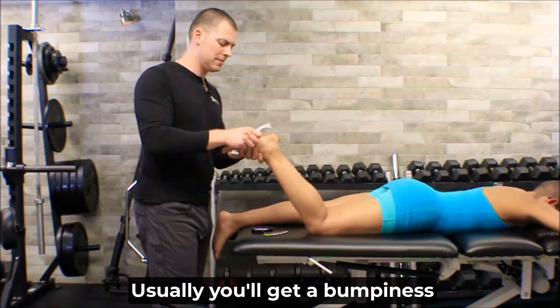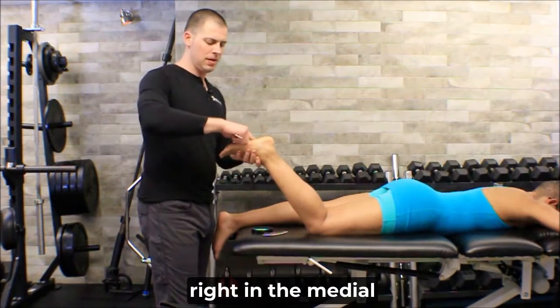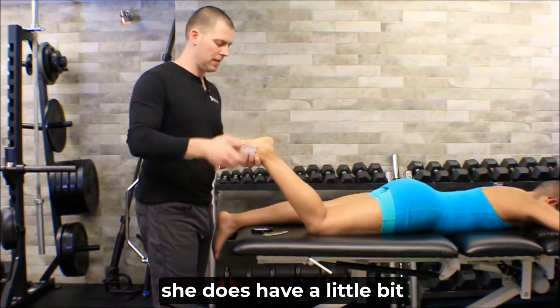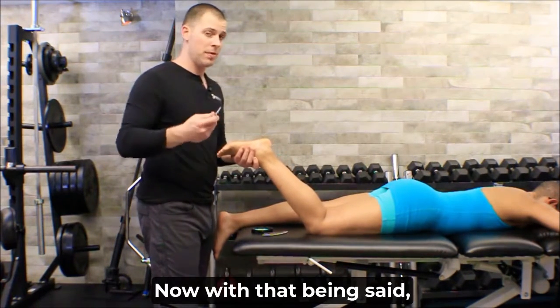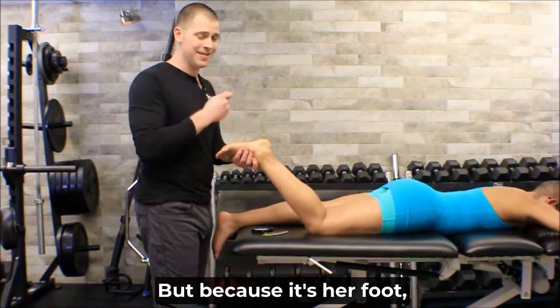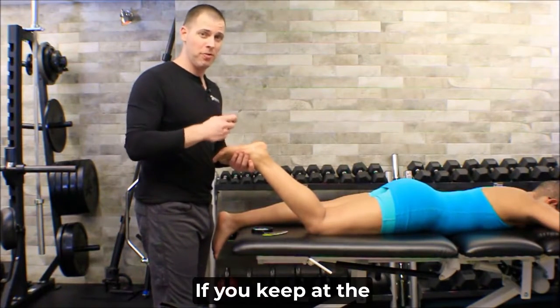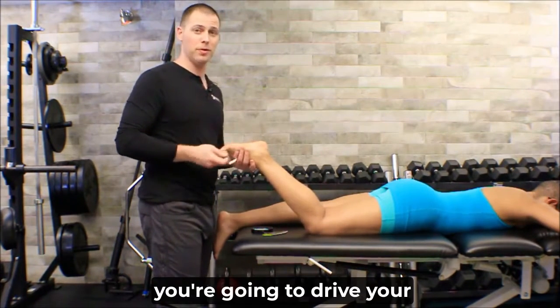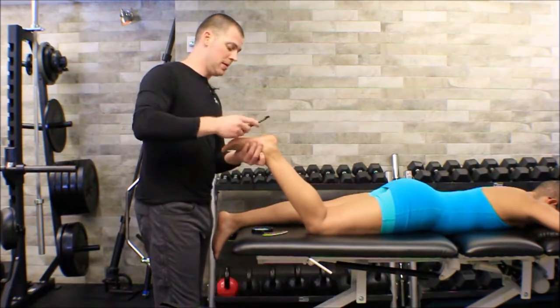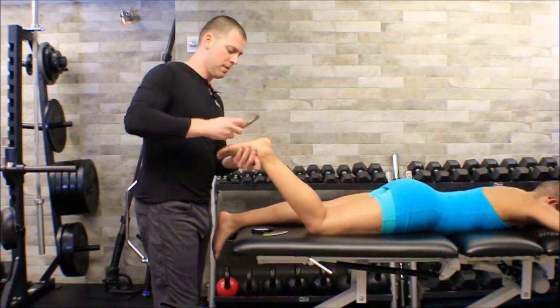Usually you get a bumpiness in areas where we think there might be some dysfunction. And right in the medial longitudinal arch, she does have a little bit of that bumpiness. Now, with that being said, I want to go through in different directions, but because it's her foot, I want to be intentional and quick. If you keep at the plantar fascia, you're going to drive your client or patient right off the table. So I'm just going to go in a couple different directions here, right?